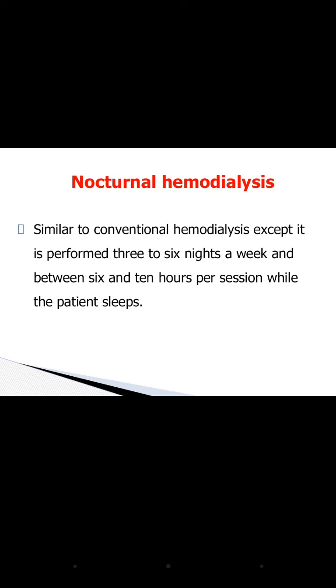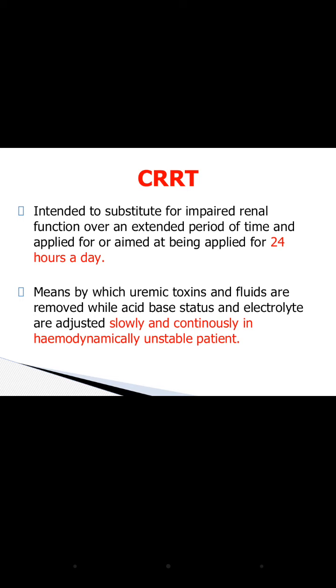Then nocturnal hemodialysis, as the name suggests, is performed during the night, when the person sleeps. It has similar properties to conventional hemodialysis, but it is performed 3 to 6 nights a week and between 6 and 10 hours per session when the patient sleeps. Then continuous renal replacement therapy is done 24 hours a day, and it is usually done if the person is hemodynamically unstable.